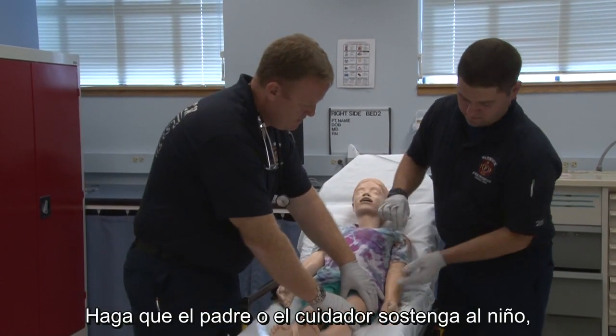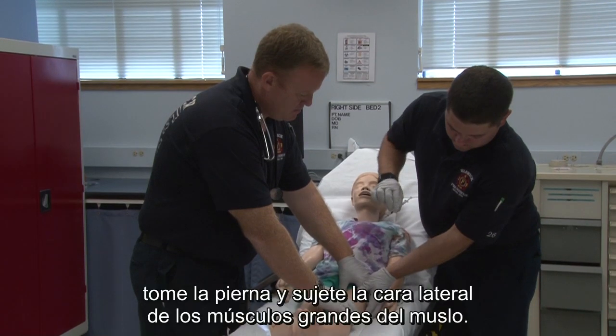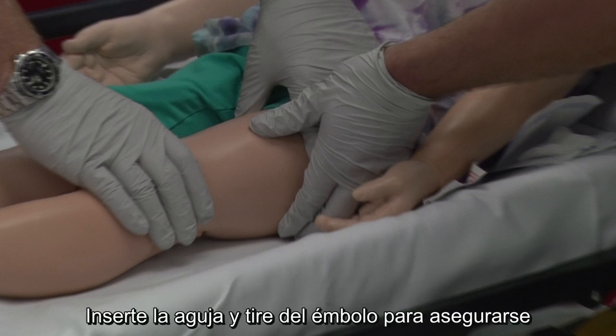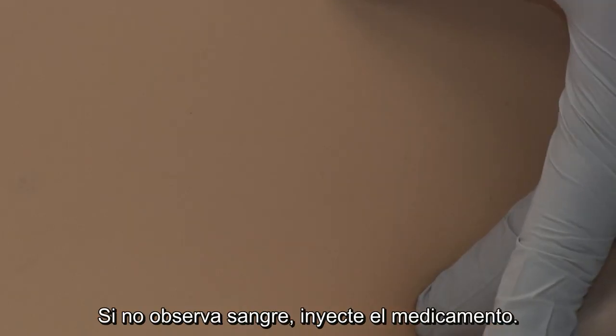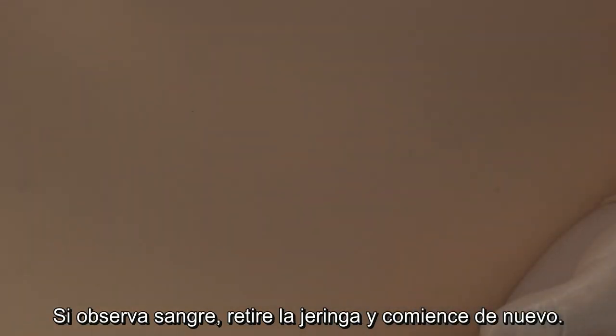Have the parent or caregiver hold the child. Take the leg and hold the lateral aspect of the large muscles of the thigh. Insert the needle and pull back on the plunger to ensure no blood is present before injecting the epinephrine. If no blood appears, inject the medication. If blood appears, remove the syringe and start again.